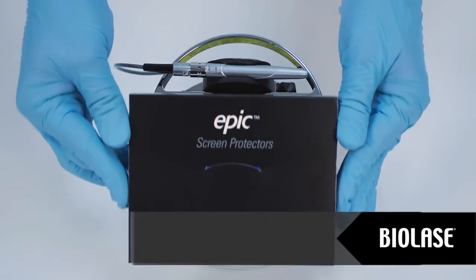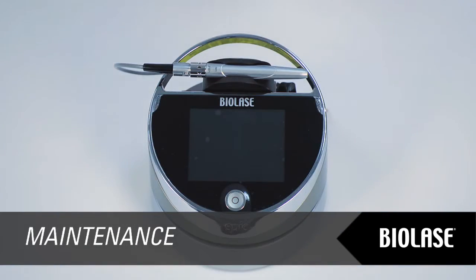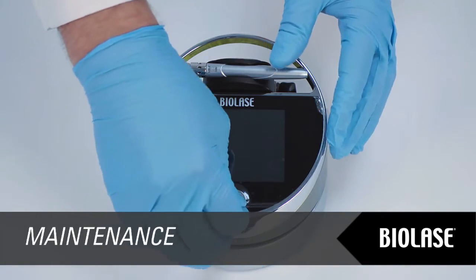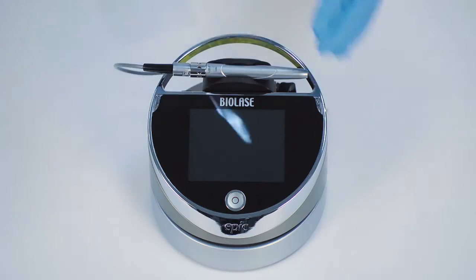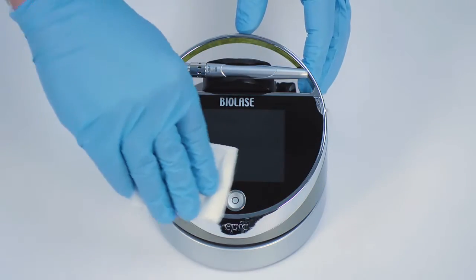Use the peel-off clear covers for the Epic console supplied with the system. After each patient, use disinfectant to wipe down the front panel and handpiece holder of the Epic after each procedure. Do not use bleach or abrasive cleaners.